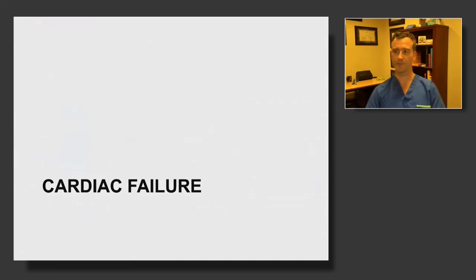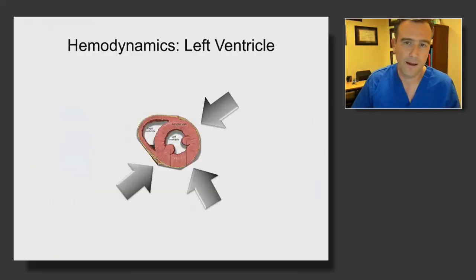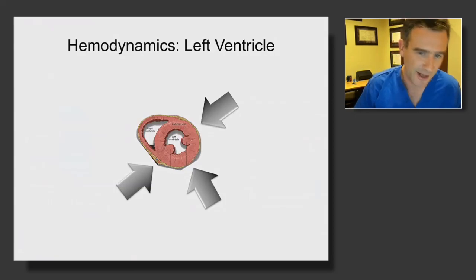The basic approach I'm advocating for is trying to understand the exact mechanism that is the reason why they're still on the ventilator. So the first and most common cause of a failed spontaneous breathing trial is actually heart failure, not lungs, not respiratory muscles, but actually cardiac failure. And why is that? Well, I showed this image the other day in the course of our discussions about the potential risks and complications of mechanical ventilation.